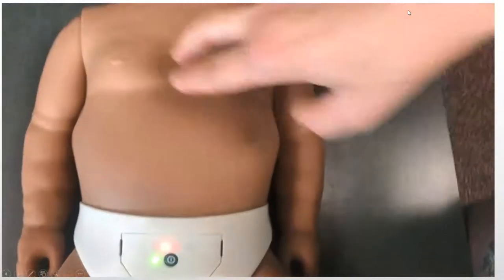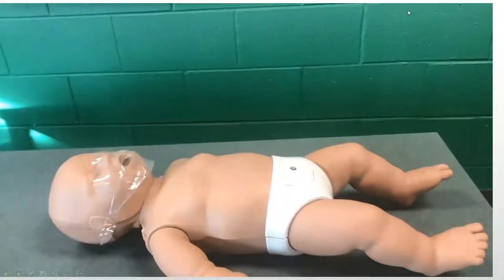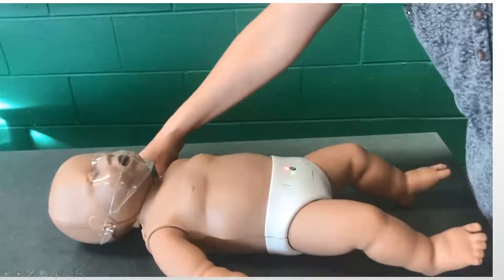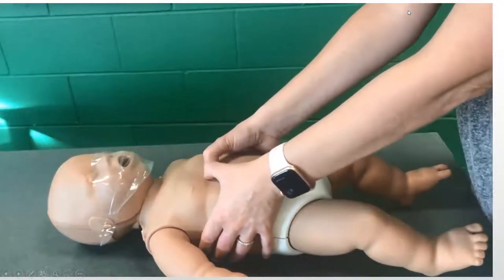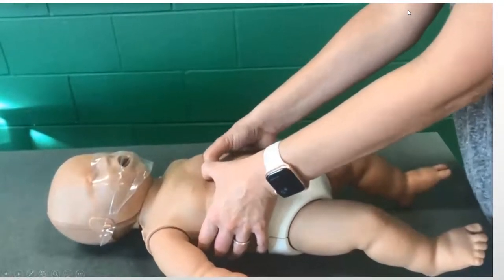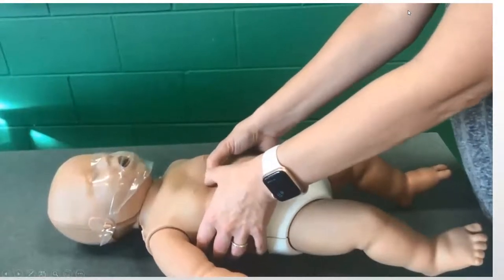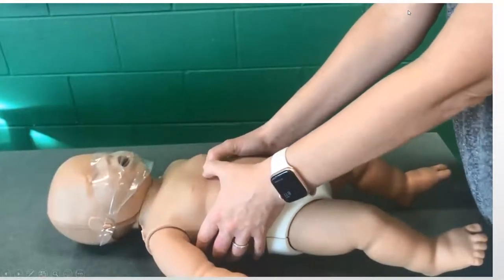You're going to do 30 compressions. When we switch to two-rescuer CPR, one person is up by the head doing rescue breathing while the other switches to the two-thumb circling-hands technique and also switches to 15 compressions: 1, 2, 3, 4, 5, 6, 7, 8, 9, 10, 11, 12, 13, 14, 15 — and breathe and breathe. Then repeat another set of 15 — and breathe and breathe.